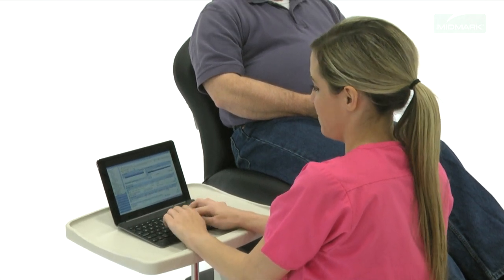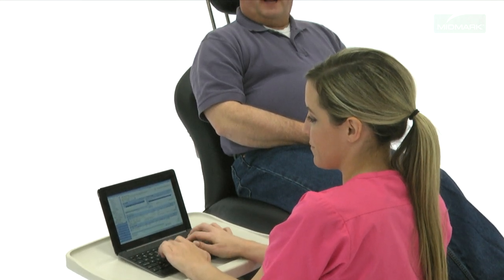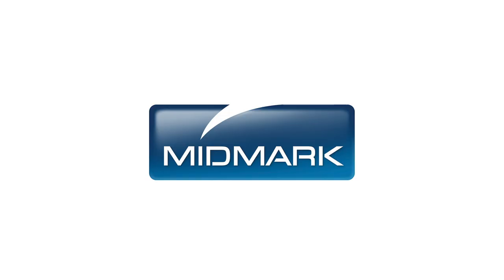Attached to either side of the 641 chair, this location enables eye contact with the patient while accessing records or entering data. For more information about accessories to enhance your Midmark 641 barrier-free power procedures chair, contact Midmark Support Services at 1-800-MIDMARK.